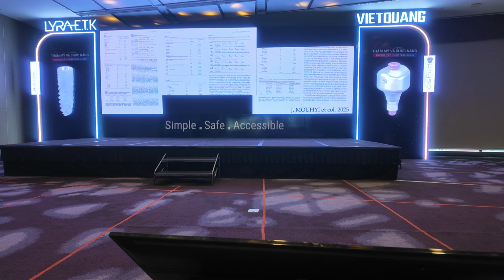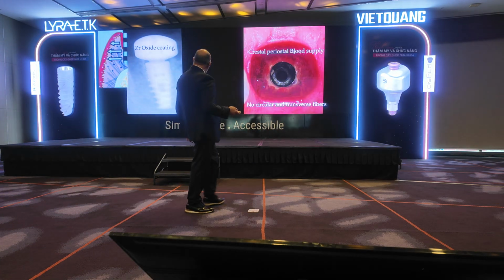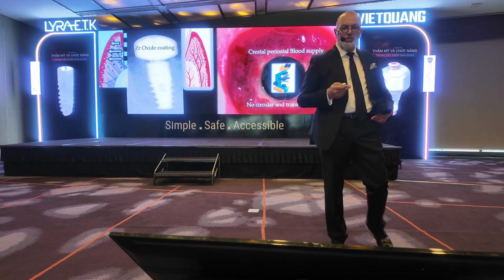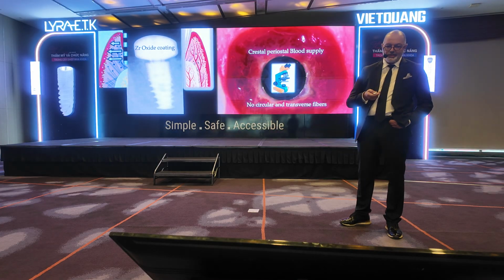It means that all the workflow was perfect, and also the contact points. If we want to use the eye physio as a scan body, we need to know if this eye physio is really interesting to use as a digital tool. Okay? Anyhow, it was interesting to understand what happened in real life, in clinical studies.